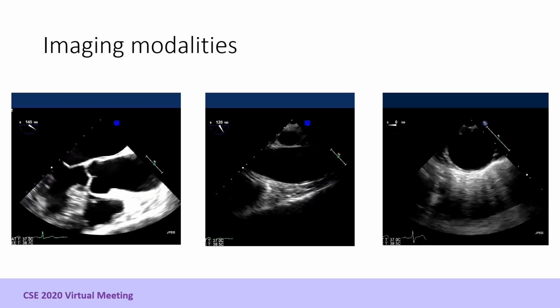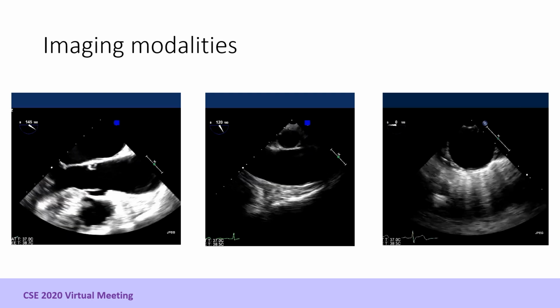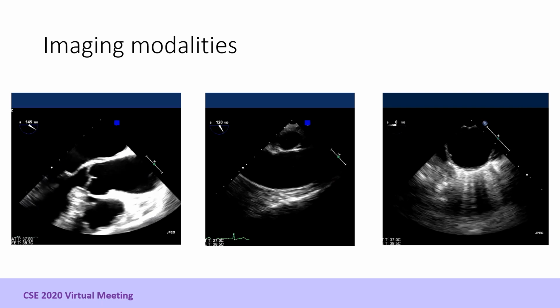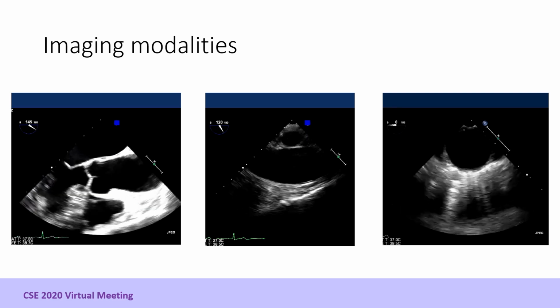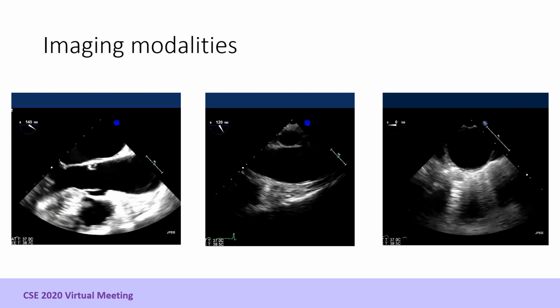The probe is rotated posteriorly to assess the descending aorta, which is much better seen on TEE than TTE, at 0 degrees for a short axis view and 90 degrees for the long axis. With further withdrawal of the probe, the aortic arch and ideally the branch vessels are seen, although this can be challenging with the potential for blind spots due to interposition of the trachea.